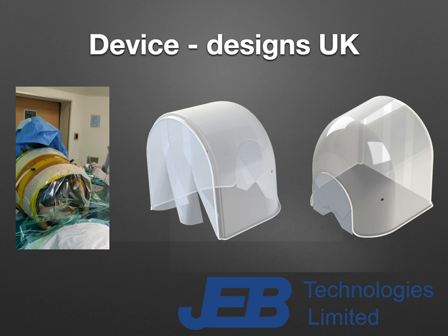We do perform critical care procedures. On the neck and side, the ODP or anesthetic technician can apply Sellick maneuver or cricoid pressure or can pass on the bougie and things like that. So both ends open is very, very important. On the left hand side, you can see the prototype being used by the anesthetist who is in PPE.